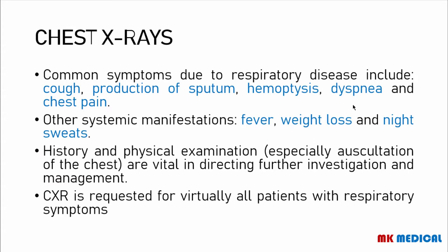And if you're already rotating on your wards, in any other department, be it pediatrics, be it surgery, be it internal medicine, obs and gyn, not so much. But in some cases, we may even order X-rays. So you may have seen that chest X-rays are ordered almost on a daily basis. And we order chest X-rays for various reasons.